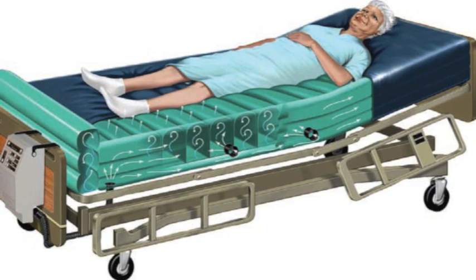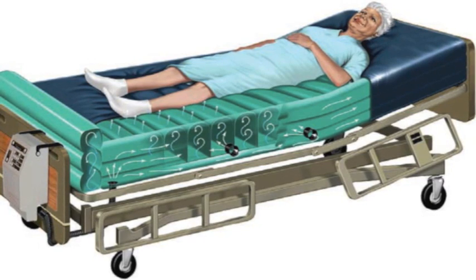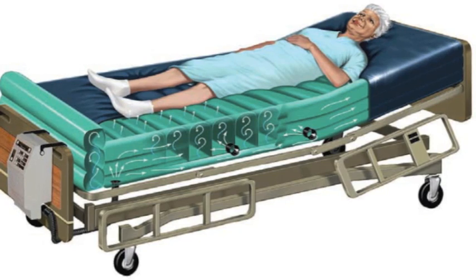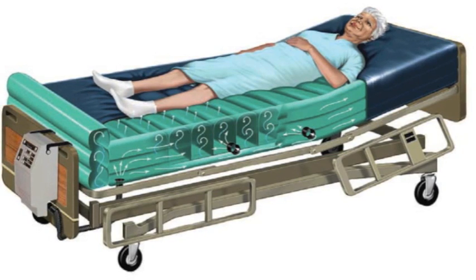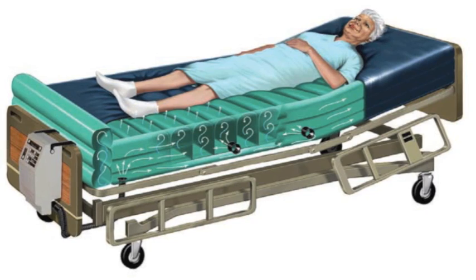Once the patient is on the mattress, make sure they are immersed 40 to 50%. If they are not, adjust the comfort level to reflect this percentage. Once this is complete, place your hand under the mattress to ensure adequate clearance of the patient to the bed frame. There should always be 3 to 4 inches of clearance and the patient should never be touching the frame.